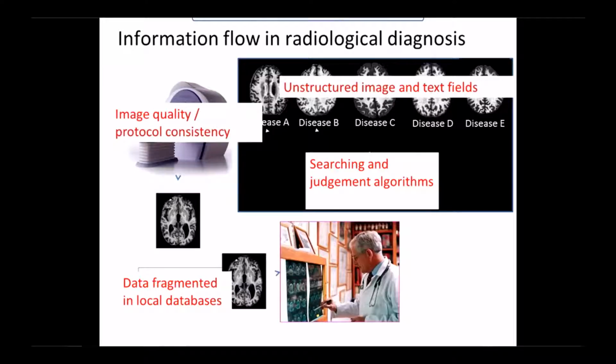So here are examples of brain MRIs in different modalities. They're all roughly at about 1 millimeter, half millimeter resolution. The rightmost picture, the color picture, is interesting because it's a structural image, but it's called diffusion-weighted imaging, and so it gives you not only contrast at a voxel like the first two on the left, which are T1 and T2, but it also gives you orientation or direction of the wiring of the brain. The bottom shows some disease associated with stroke, and MRI is used heavily there as well. So that's just to show the kind of data. This is all at roughly the 1 millimeter scale.